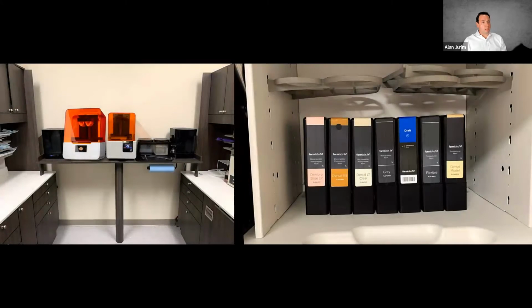So here is where we print in my office, and you'll see two printers on the left-hand side. Actually, one of them in the middle is our older Form 2 printer. It's the previous version than the Form 3B that you see to the left of it. And the Form 3B is the latest and greatest for dental printing. It's incredibly robust and very high resolution. And again, it has a complete package for us to be able to print like the materials you see here. These are the materials that I normally use.